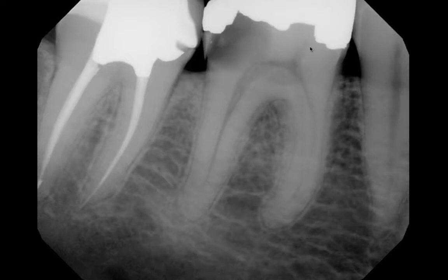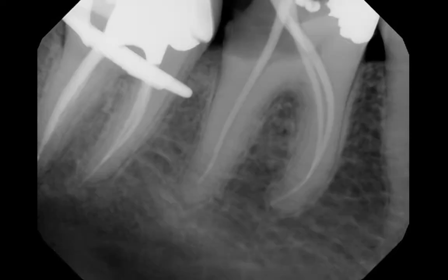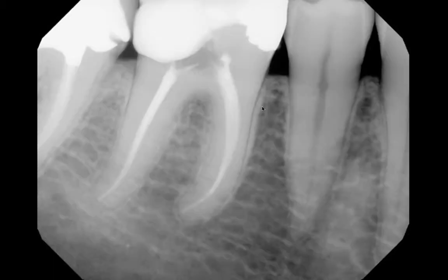Once again, the whole idea of straight-line access — where we would remove all this to get to this curve — is maybe winning the battle but losing the war of tooth retention. We can actually leave that pulp horn in place. With our flexible instruments, we can still get where we need to go and do our job. This is the way that patient left, with all of this dentin here tying together the buccal and lingual of this tooth. I believe this tooth has a much better chance of being there for a lifetime.